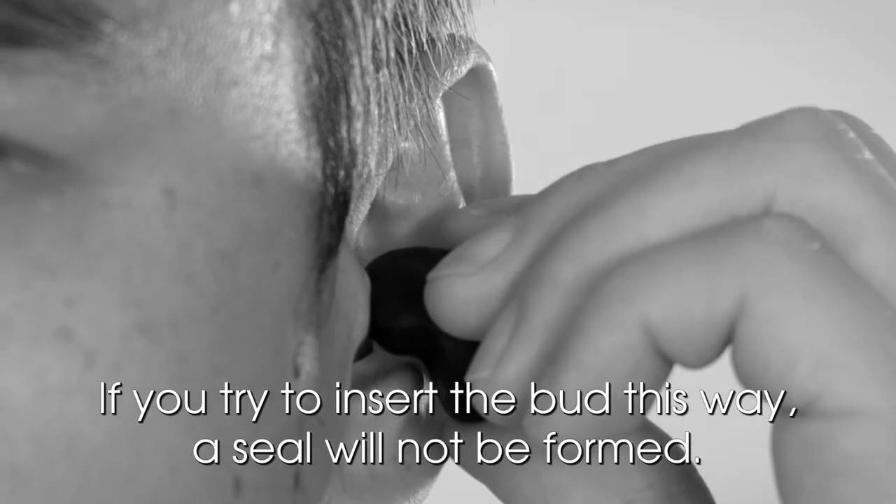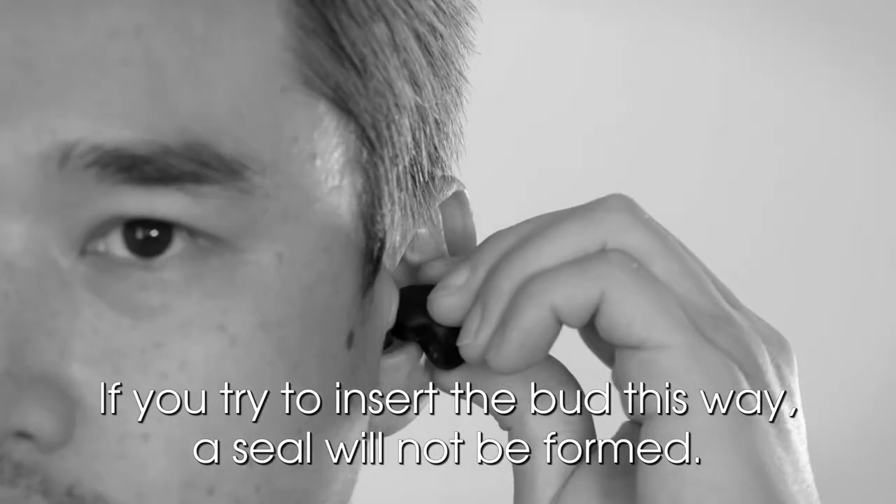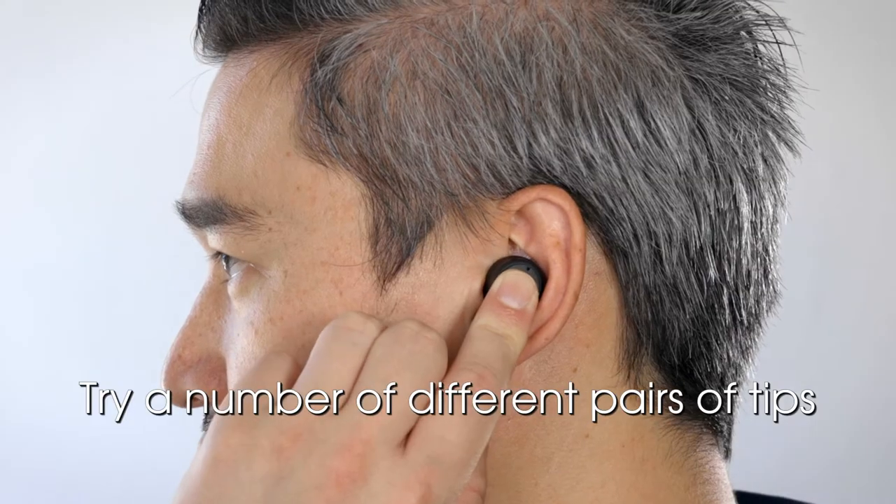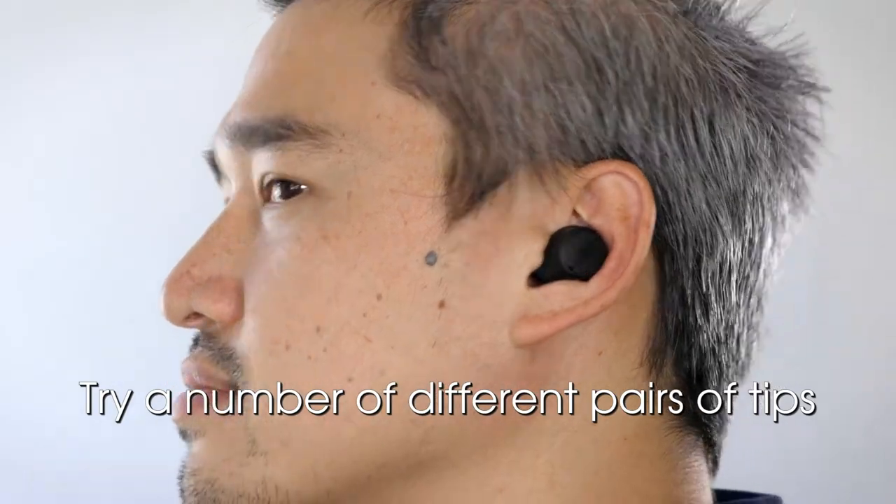If you try to insert the bud this way, a seal will not be formed. Try a number of different pairs of tips to assess which provide the most comfortable, firm seal in each of your ears.